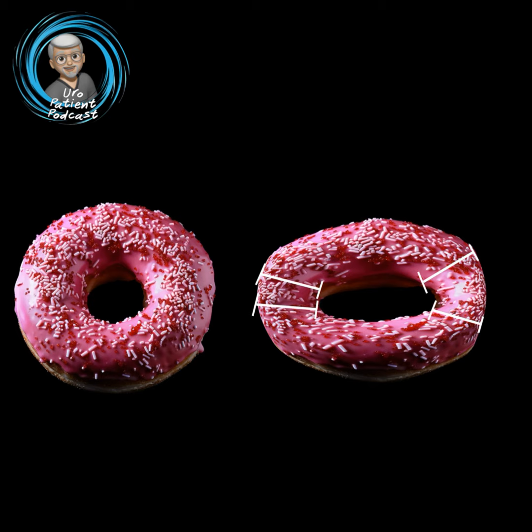needle. Attached to the nitinol tab is a length of monofilament PET suture. A third trigger pull fully retracts the needle and tensions the suture. Trigger pull number 4 completes the implant by placing a stainless steel urethral endpiece onto the suture while also cutting the suture. Depending on the prostate size and amount of blockage, additional implants may be placed in the same way. The physician will determine the number of implants needed per each individual patient to obtain an open anterior channel.